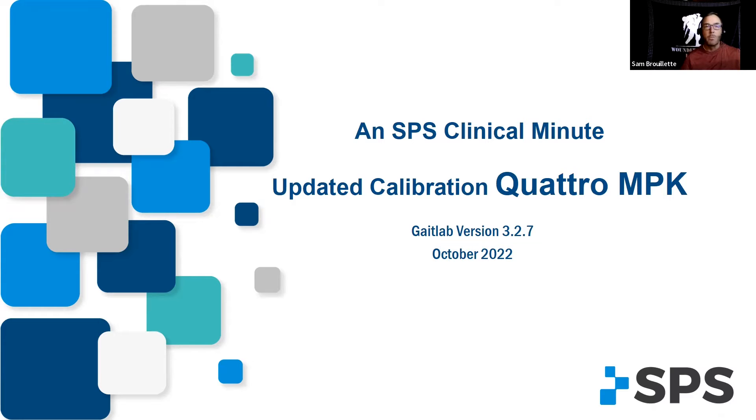October 2022, a brand new calibration came out that made it a lot easier. So if calibration was a holdup for you doing Quattro, this is a lot easier — it's extremely easy. So let's take a look at it.